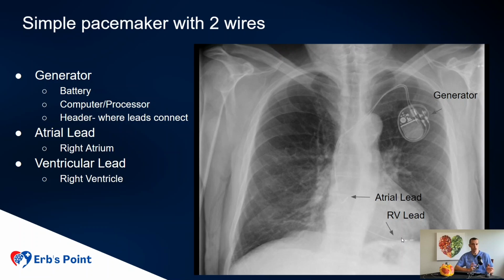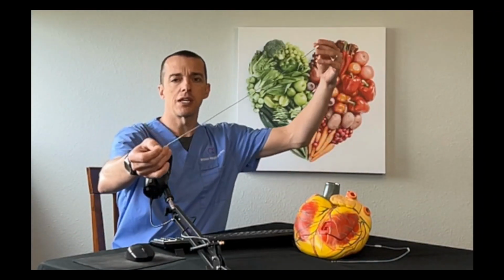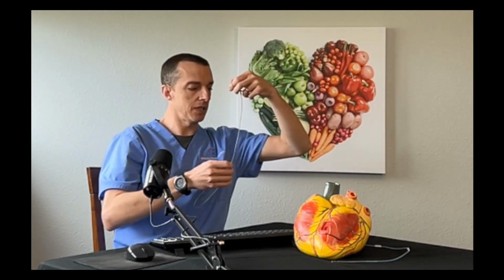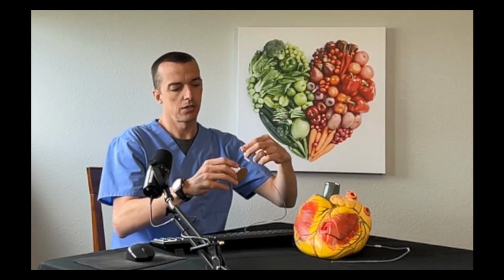This is a standard dual chamber pacemaker. There's different terminology, and again, we'll talk about that in different videos. But this pacemaker has two wires, one in the right atrium, one in the right ventricle. Just to show you what those wires look like, let me get this bigger here. Maybe kind of hard to see, but this is a wire, and this one's a little bit long, but it coils up, and again, it inserts directly into the pacemaker. We call this the header.